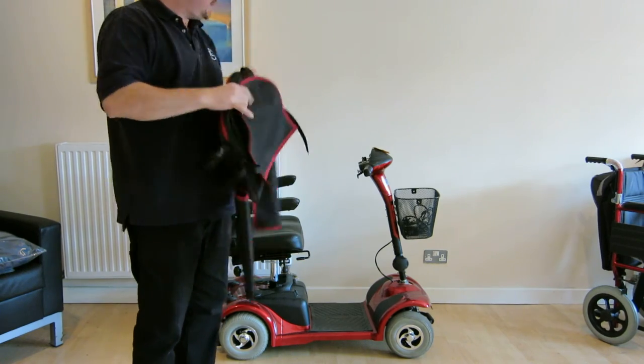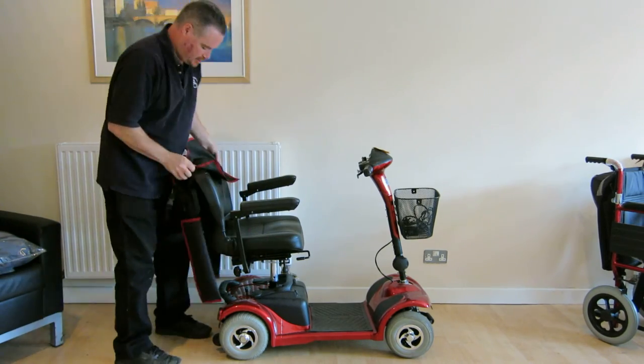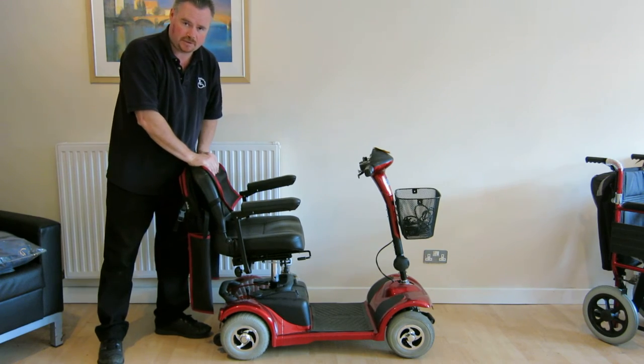And as I say, that fits quite nicely and securely on the back of the chair. So that's the first accessory option that we offer.